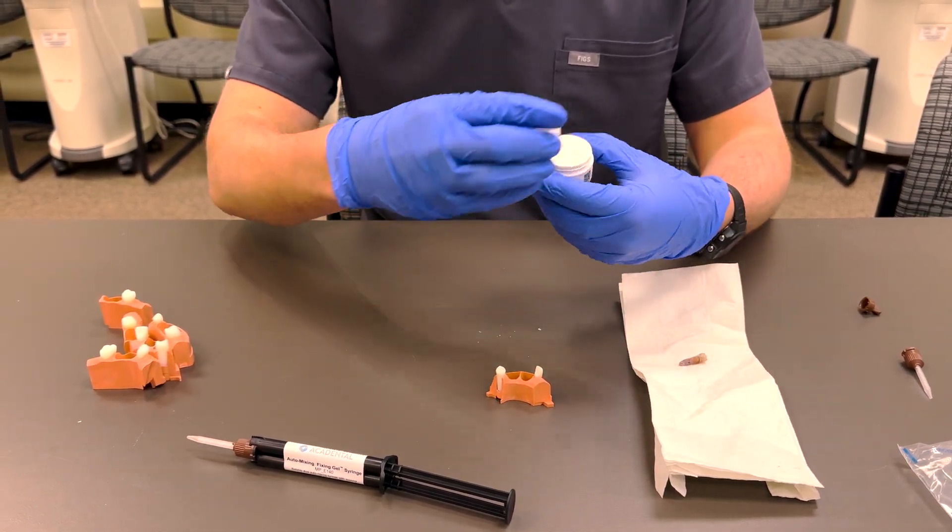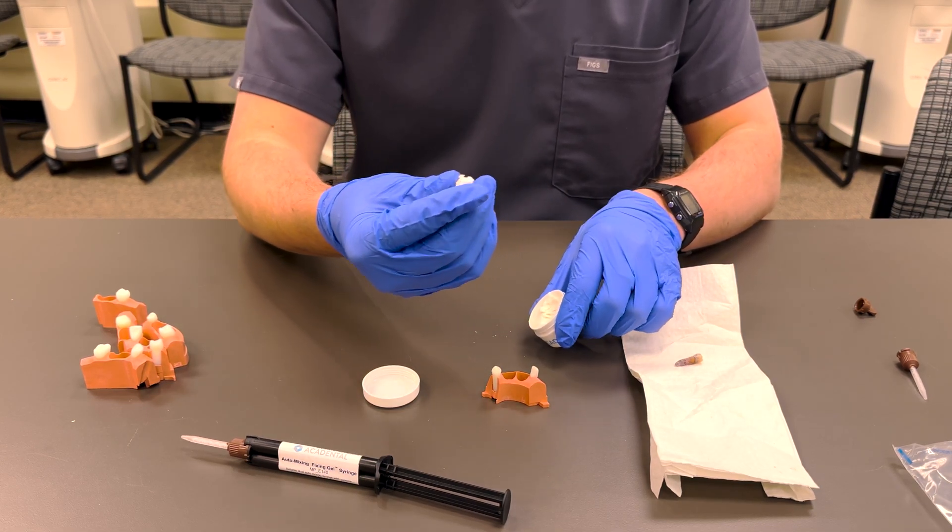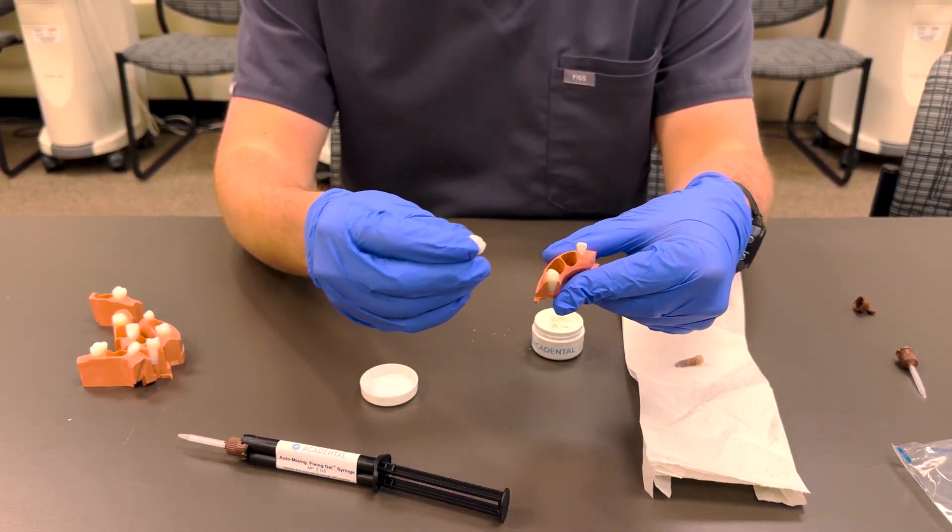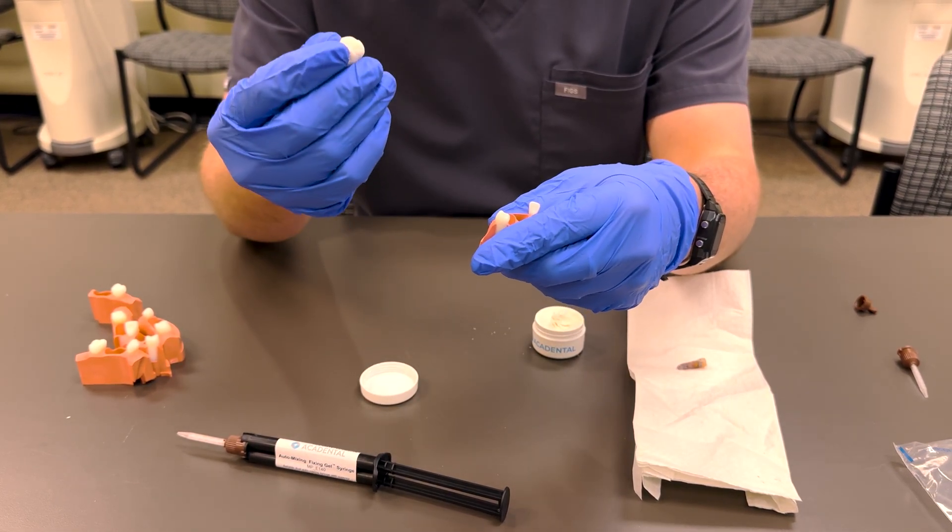What you'll do is take out your apex putty and scrape off some of this. It has a consistency like play-doh. You're going to fill the hole where you're mounting the tooth with this apex putty.